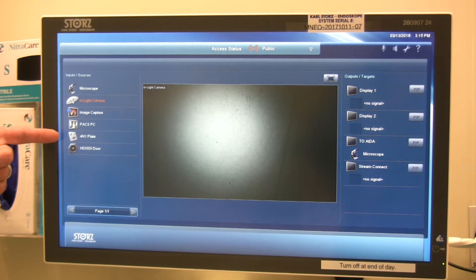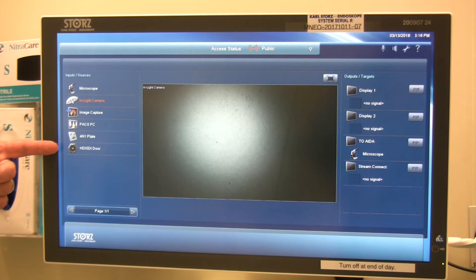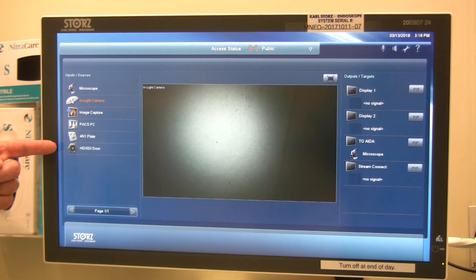We have a 4-in-1 plate that has an S-Video, a VGA, a composite, and a DVI input to plug mobile devices in to route video from. We also have an HD-SDI door plate located by the main door in each operating room, for portable devices that have an HD-SDI output — like many of the microscopes in the department.